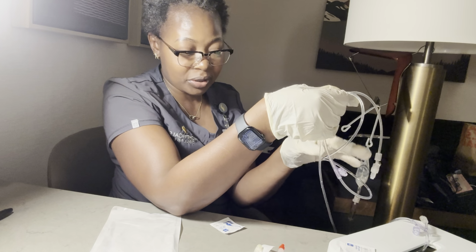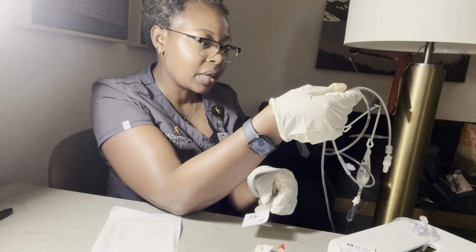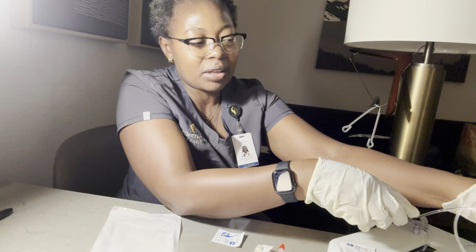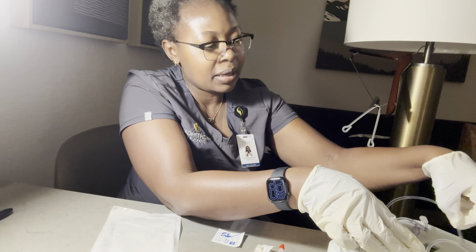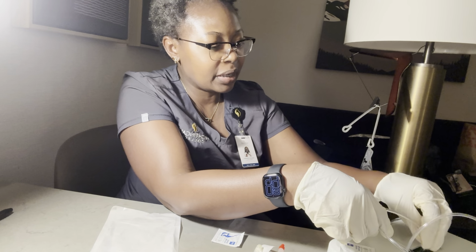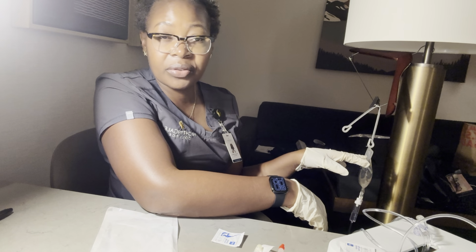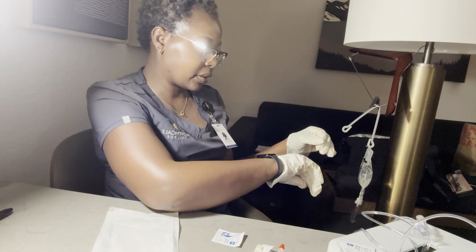I will at this point clean my connection site to the IV, and since I don't have an IV, I'm not going to do that, but in real life that's what I'm going to do, and connect it to the IV site. Then I'll go ahead and calculate my drops per minute. I'll be using 38 drops per minute on this one, so I'll go ahead and calculate that.